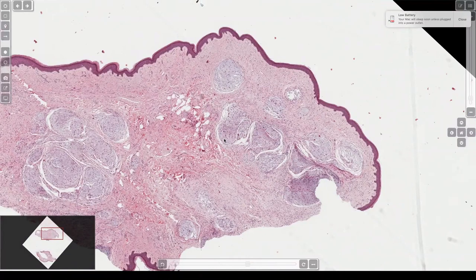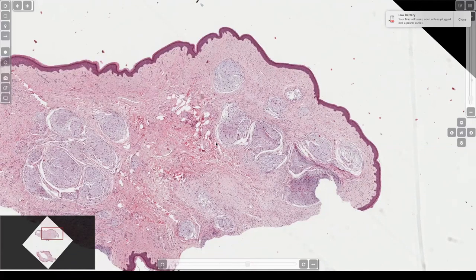This is called a dermal nerve sheath myxoma. In the olden days, this was called conventional or myxoid neurothecioma. Later, people found things that looked kind of like this but had nodules that were cellular — histiocytoid cells — and said these are cellular neurotheciomas. But once we got immunostains, we found that all those cellular ones are dead negative for S100 and SOX. They're not neural. We don't really know what they are, but they're something totally different.